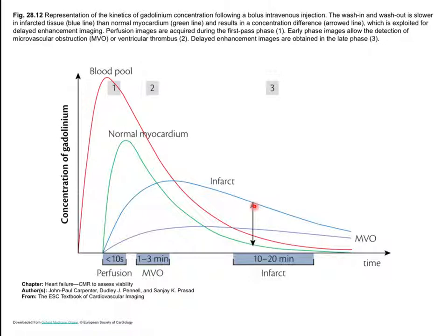And I think this is probably one of the most valuable imaging applications of cardiac MR, looking at a very precise picture of the damaged tissue. If someone has had a heart attack and you want to know how they fared after that heart attack, you do one of these delayed enhancement pictures, and you can see how they're doing.